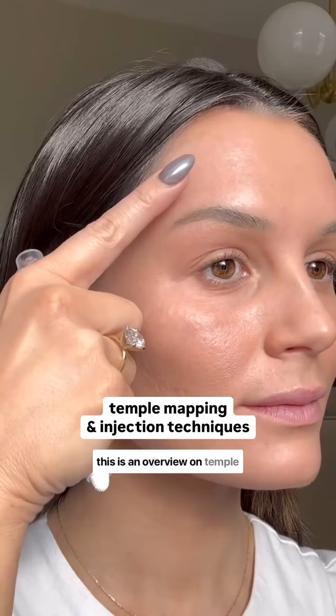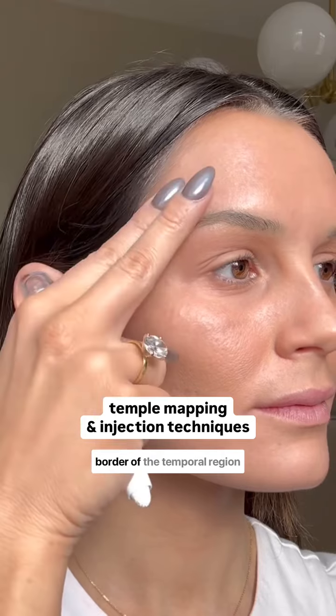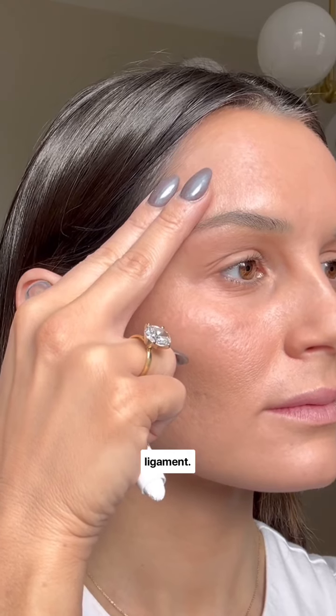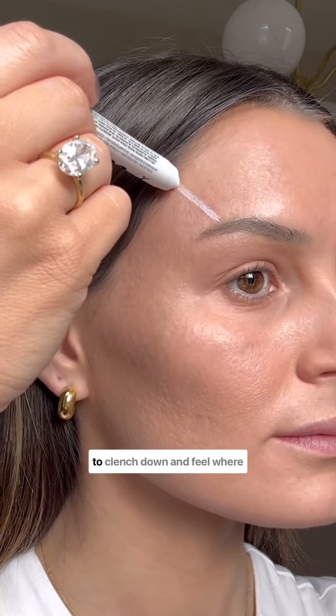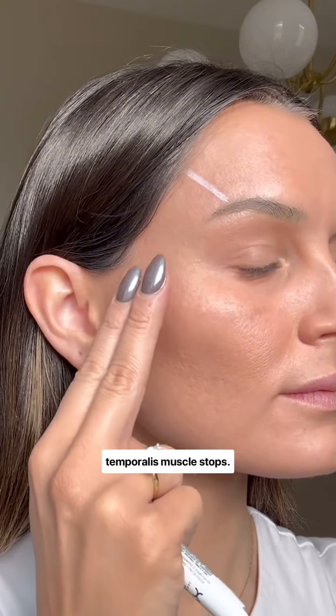This is an overview on temple mapping and injections. First, locate the superior border of the temporal region, which is the temporal fusion line. This is also the location of the superior temporal septum ligament. This landmark is easier to palpate closer to the brow, but if you're still having difficulty, ask your patient to clench down and feel where the contraction of the temporalis muscle stops.